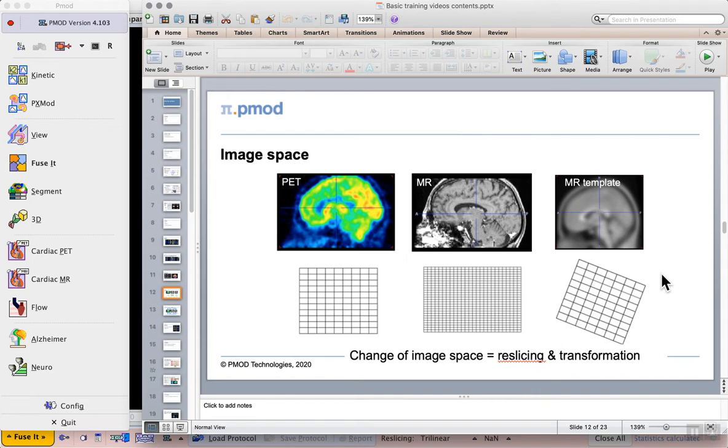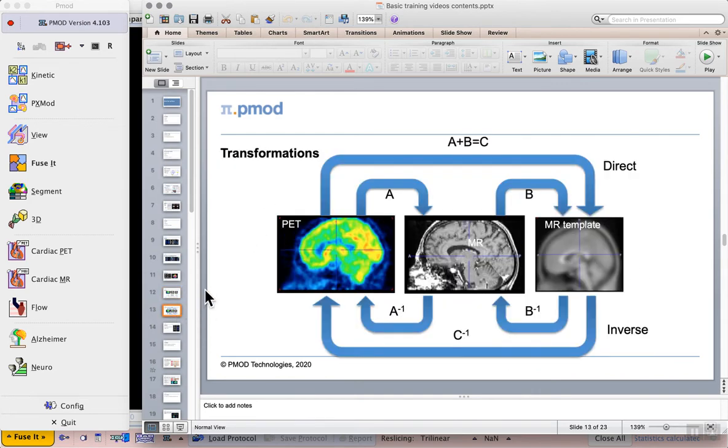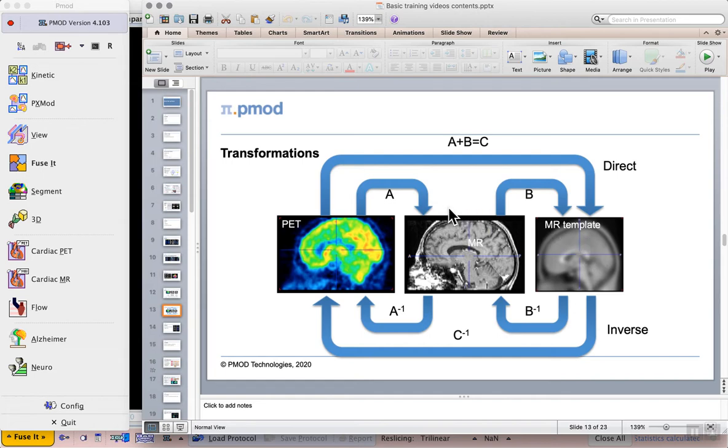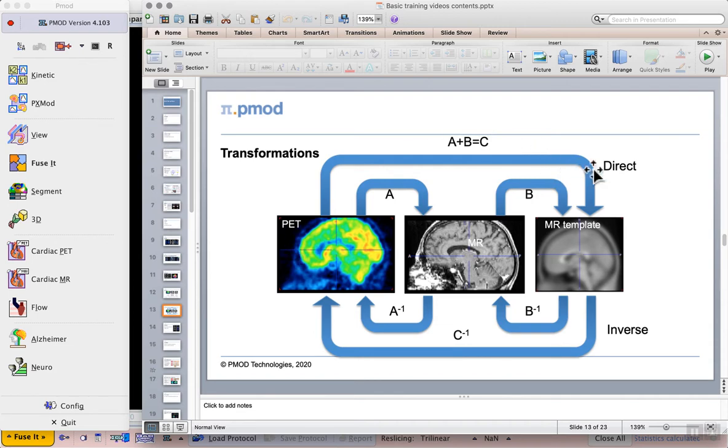If we consider these three parts of a transformation then in fact we have a transformation here labeled A between our PET and MR data and then another transformation labeled B from the MR data to the MR template. And if we were to mathematically combine these transformations so that we can go directly from the PET to the template then we would have a direct transformation C that performs that for us.